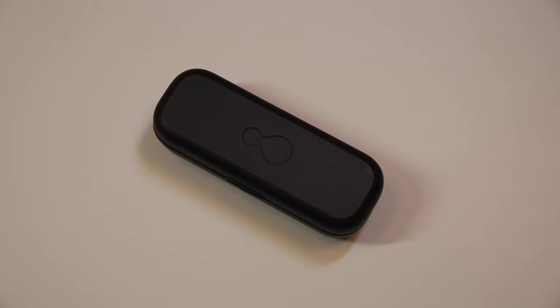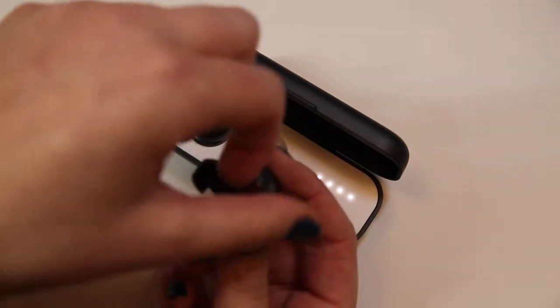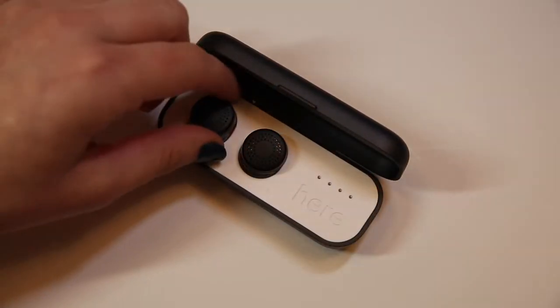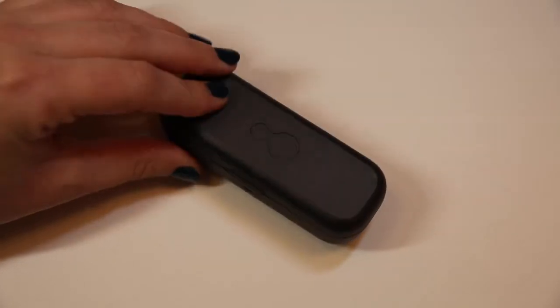Let's make sure HearOne is fully charged and activated before continuing. Remove both earbuds from the case and peel off the protective plastic. Then place the buds back in the case and close the lid. This will activate the buds.